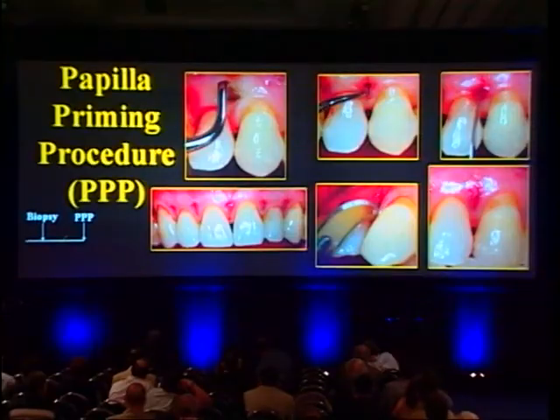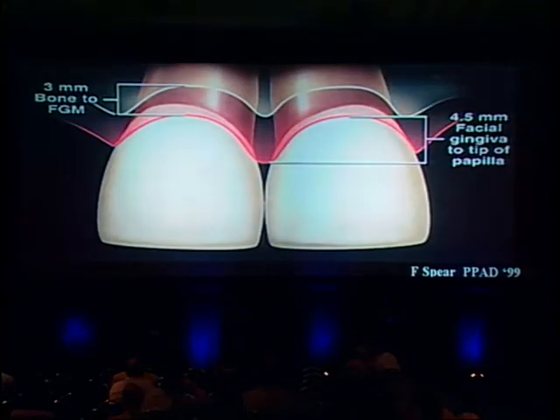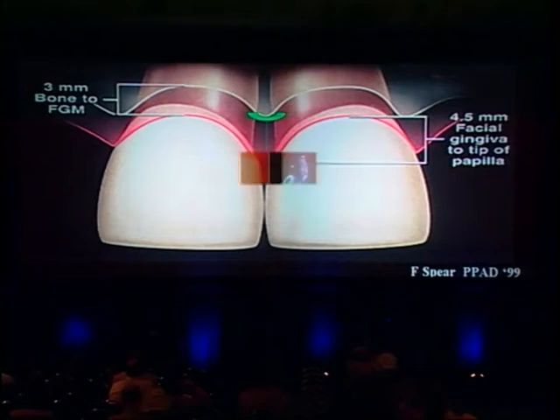So we're going in at the alveolar crest with an Orban knife, basically pivoting off of the alveolar crest, creating a little space. We then go in with a curette and follow the alveolar crest to the lingual, again just creating a space here, then taking a 12B blade and going down the papilla, not excising through it, but going down toward the tip so that we have somewhat of a little T lesion. What that allows us to do is create a little space and allow our injection to get into all the components of the papilla: the bone, the periosteum, and the soft tissue components.